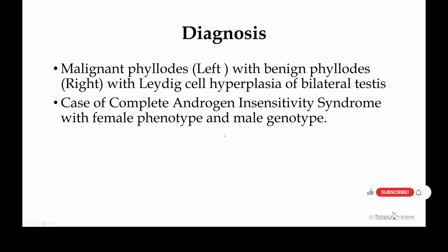But ma'am, reporting Leydig cell tumor in a 66-year-old female who already has androgen insensitivity syndrome, she has developed hyperplasia of the Leydig cells over all these years. Maybe it was ignorance on the patient's side that she had not reported it earlier when she had a smaller mass. So we went more in favor of hyperplasia over Leydig cell tumor.